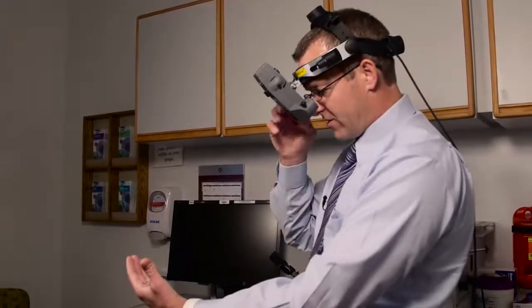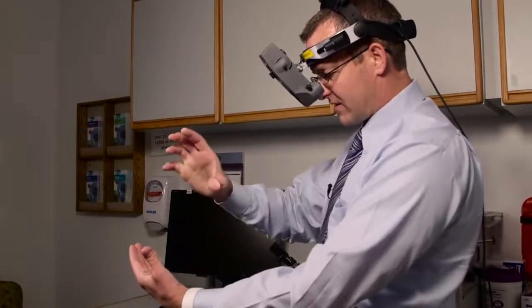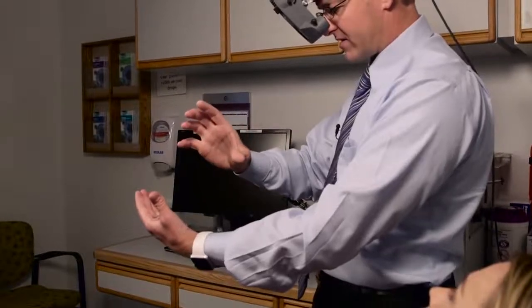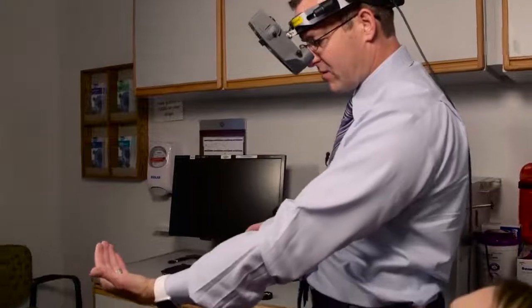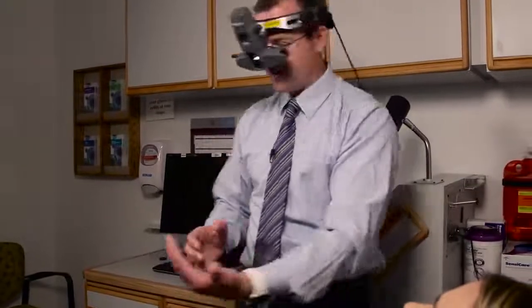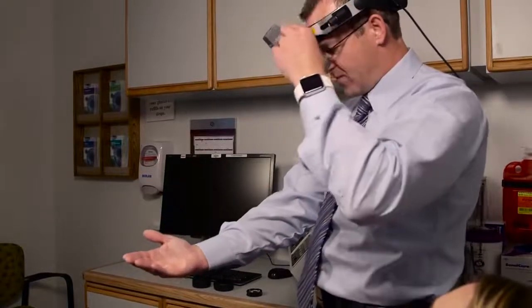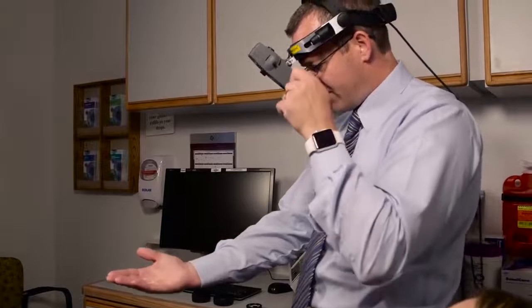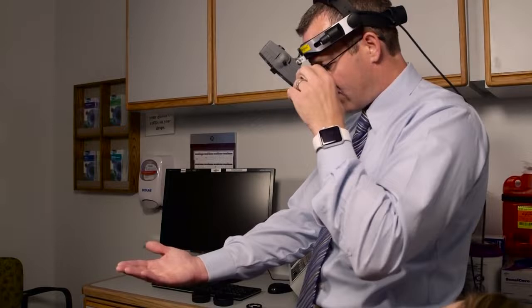So first things first, as I look into my beam and I'm looking through my oculars, the beam is a little bit down towards the bottom of my view. I want it right in the center. If you put it up here, you're not going to be able to tell. You got to put the beam a little bit away. Sometimes I'll shine it on the patient and do it, or sometimes I'll hold out my hand, okay? And so I've got it there. There's a knob here on the left that moves the beam up and down. Okay, so just move it so it's right in the center of your oculars.